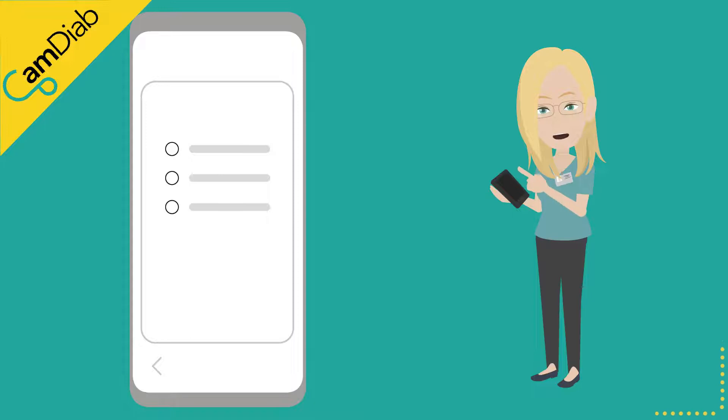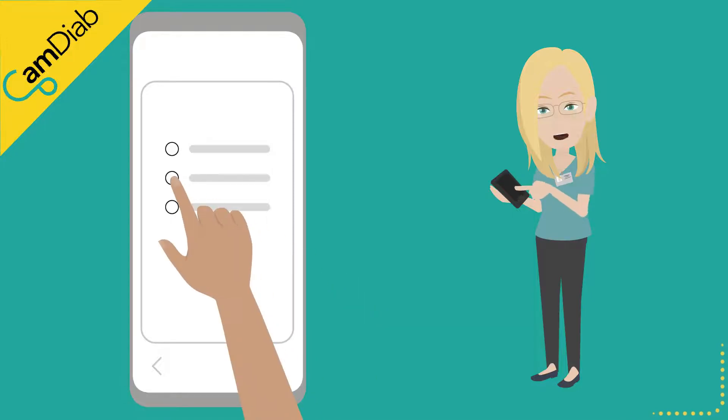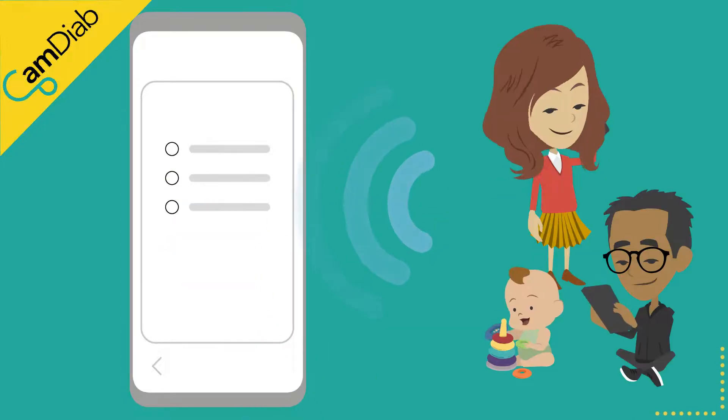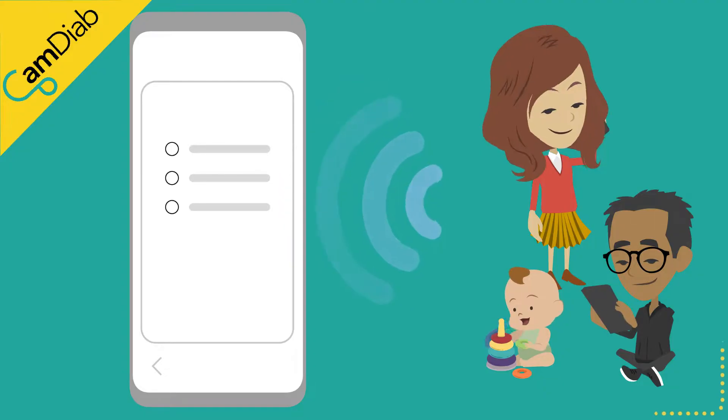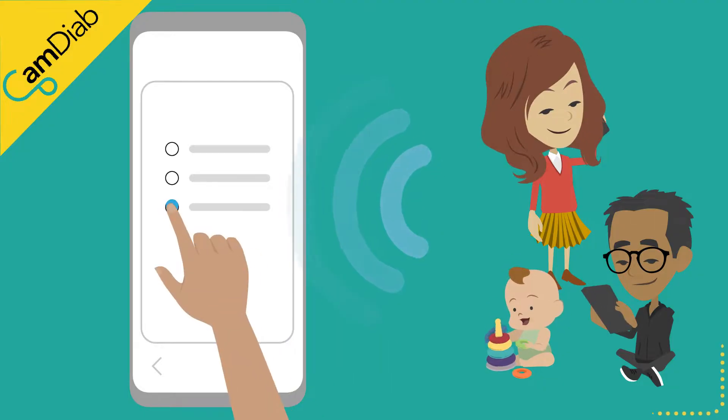If you wish to practice using the app, please select the virtual pump. If you have been invited to receive real-time insulin and glucose data from someone else with type 1 diabetes using MyLifeCam APS-FX, please select companion.